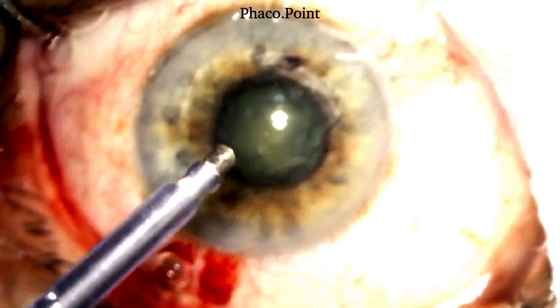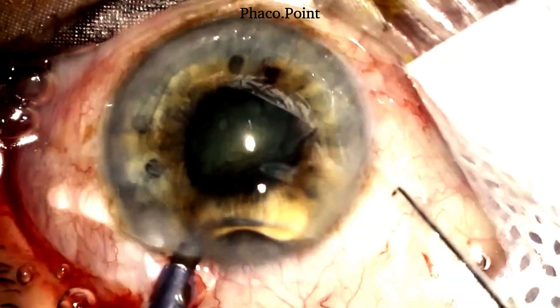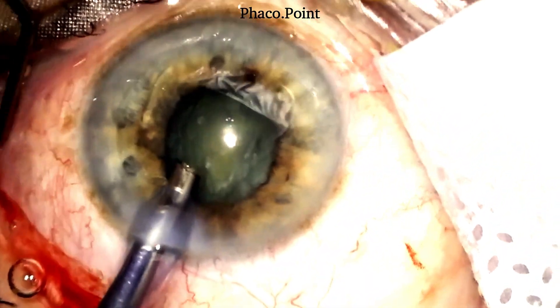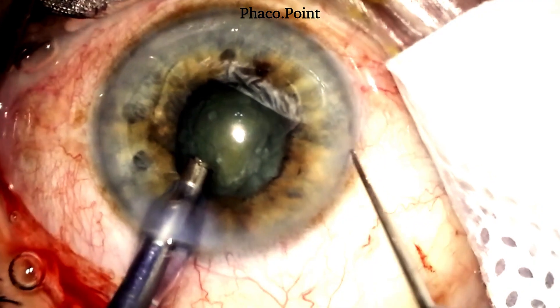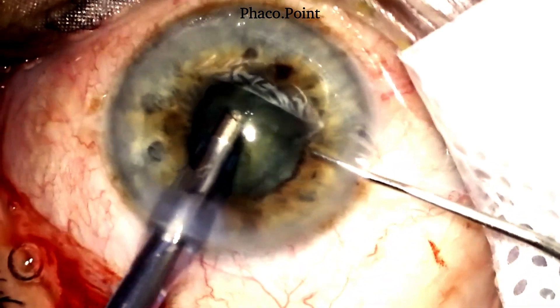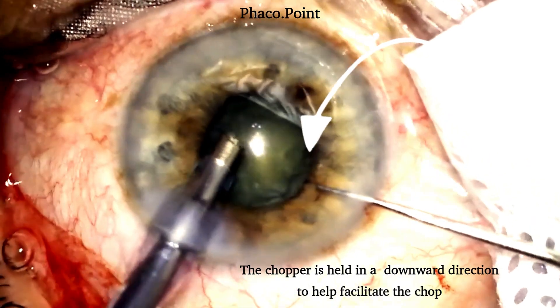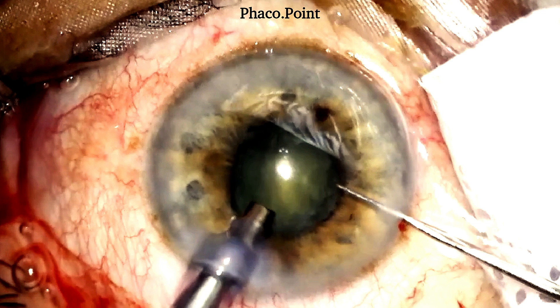Let's now get to the nucleus management. With the irrigation on and the bevel facing downwards, the phaco probe is introduced into the eye, after which the tip is rotated so that the bevel faces anteriorly. Note the second instrument — you always need a sharp chopper to perform a direct chop. The sharp chopper is introduced through the paracentesis incision and held in a downward-facing position, ready to perform mechanical disassembly once the probe is impaled.